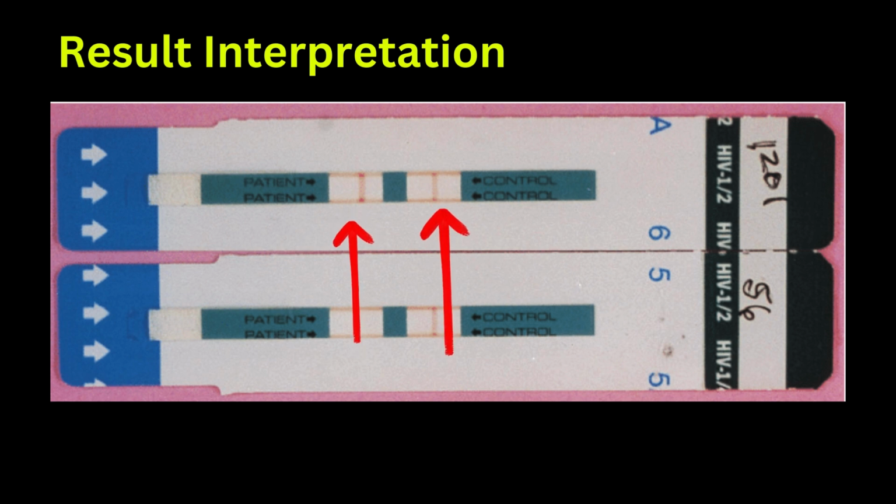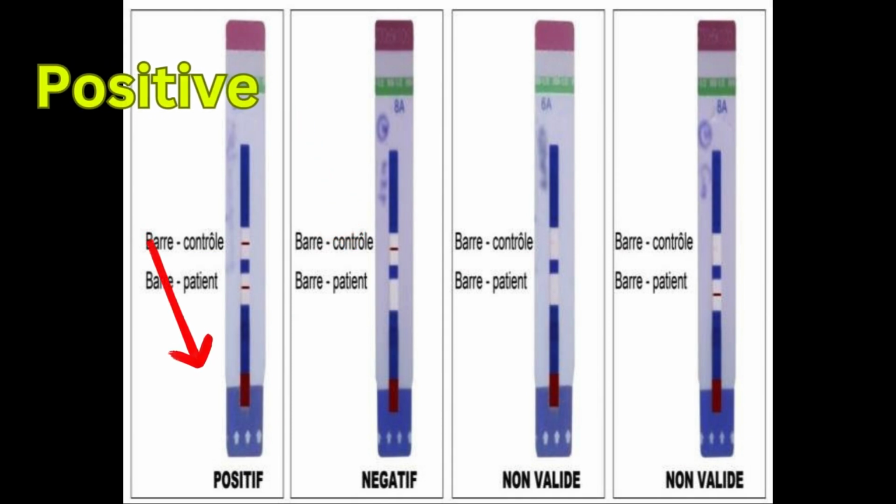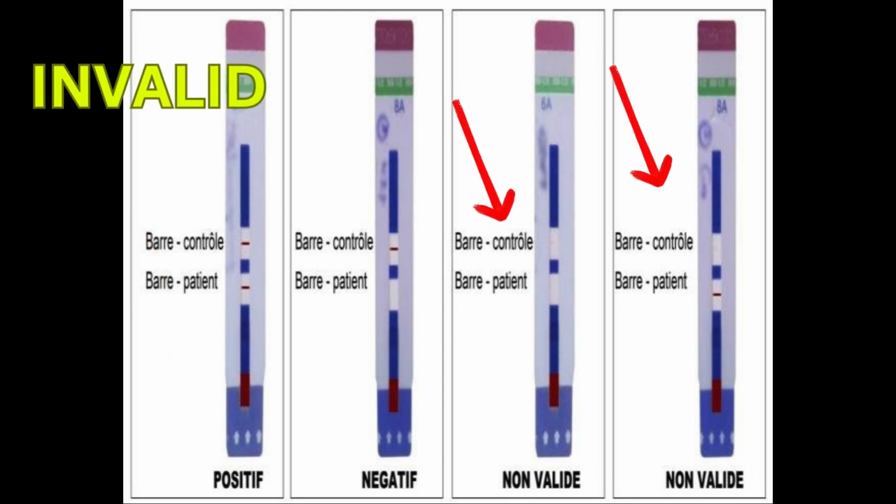Your results can be interpreted as follows. Negative. You are negative if only the control line appears. Positive. You are positive only if both test and control lines appear. Invalid. Your test is invalid if no control line appears, regardless of test line presence.